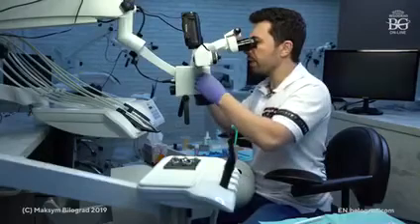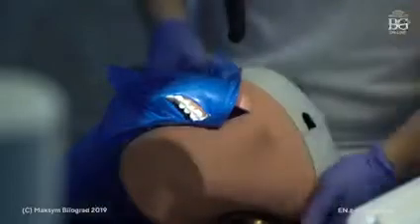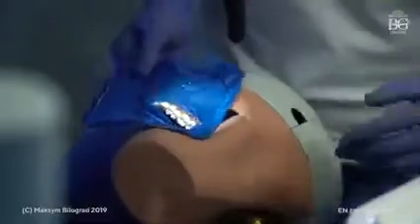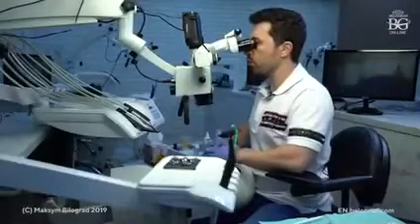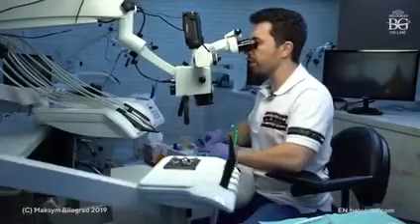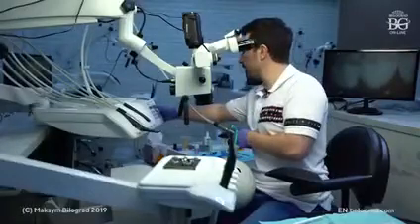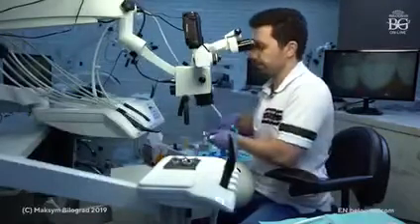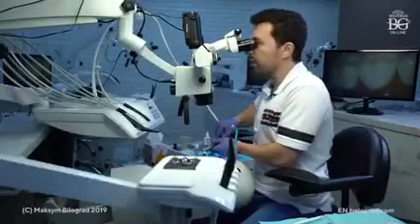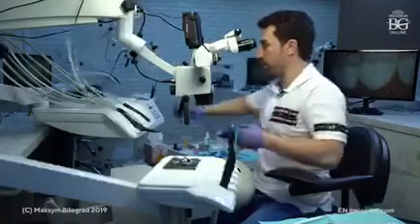Okay, so during the second stage of preparation, we will increase magnification. If you work with a microscope, you increase magnification. Okay, we put on the red diamond. We will also decrease speed. The speed will be about 50-60,000 RPM. I will also decrease water amount, and I would prep the finish line.